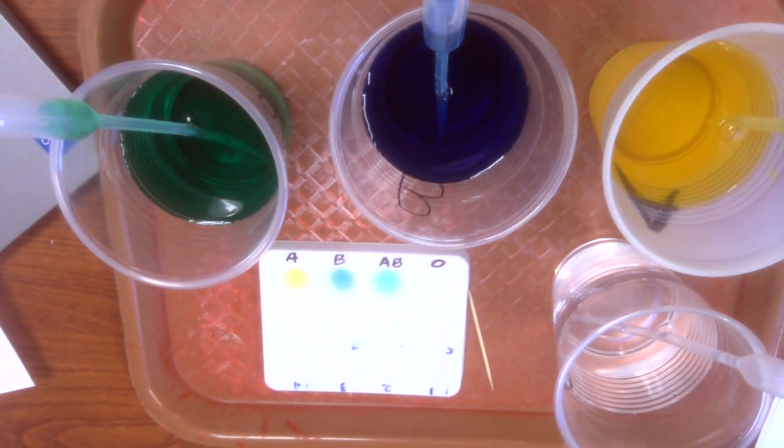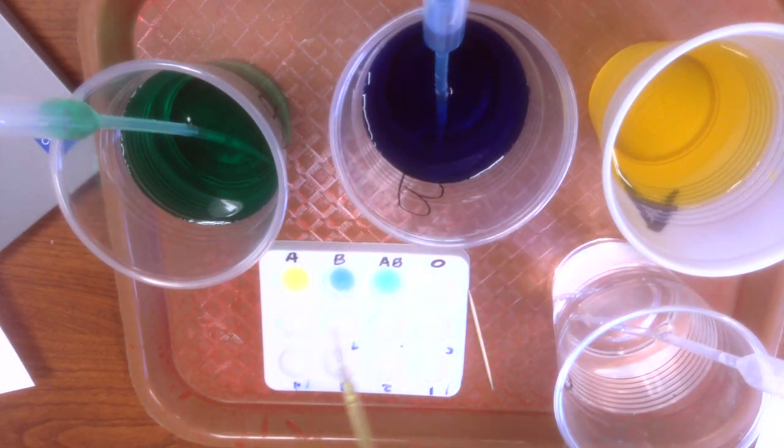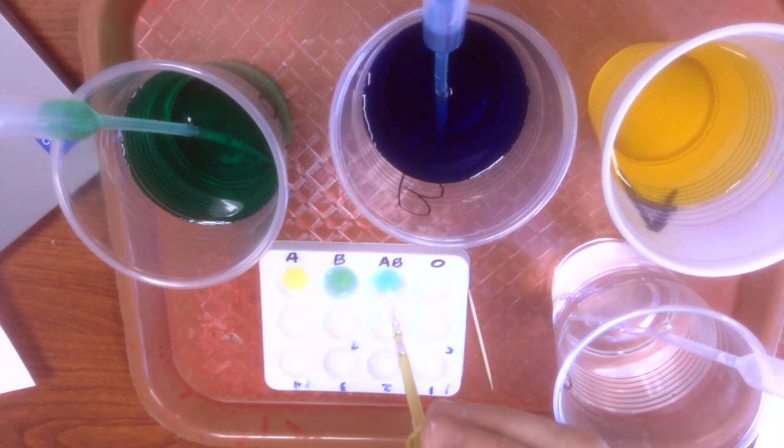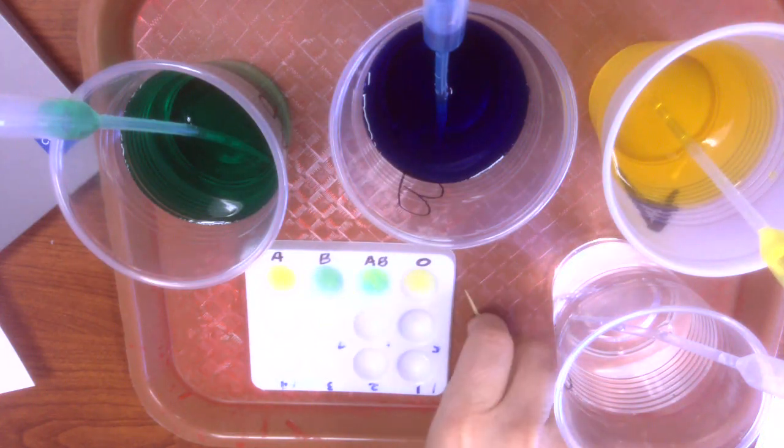So now I'm going to take type A. I'm going to add 5 drops. 1, 2, 3, 4, 5. And 1, 2, 3, 4, 5. Okay. So now I'm going to mix it up.